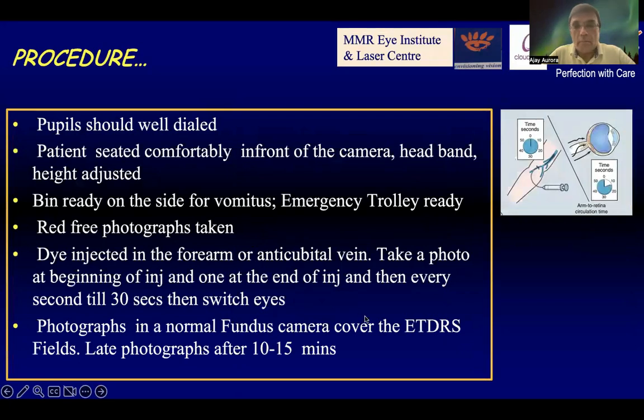Now, before we take up the patient, you must ensure that the pupil is well dilated. Otherwise, you'll not get good images. The patient should be seated comfortably in front of the camera. I would always prefer a headband, because otherwise the patient keeps moving backwards or sideways. And the height should be adjusted well so the patient is comfortable.